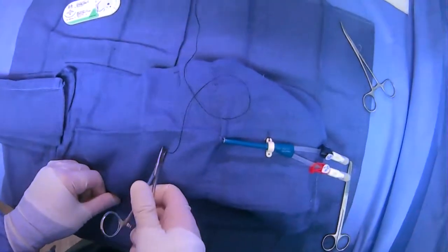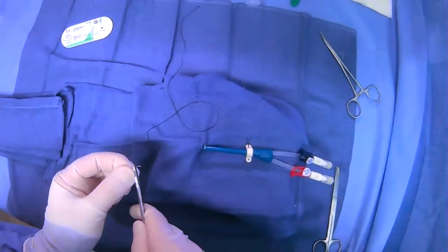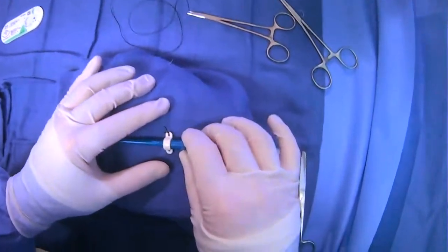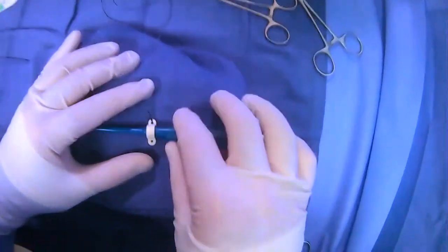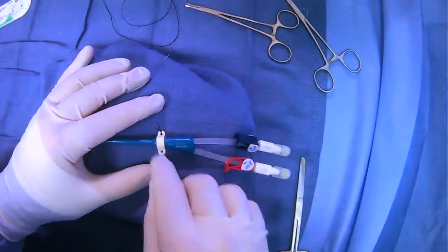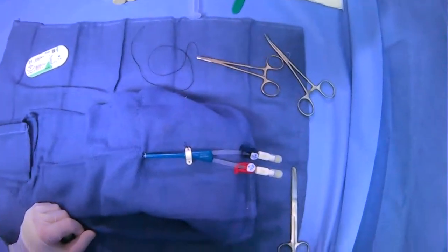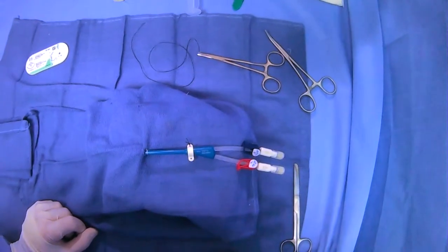Make sure to protect your sharps, of course. You can do the exact same thing on the other side — I won't show it here because I think you get the idea — and you'll have two air knots secured on both sides. That's one way to secure things like this.